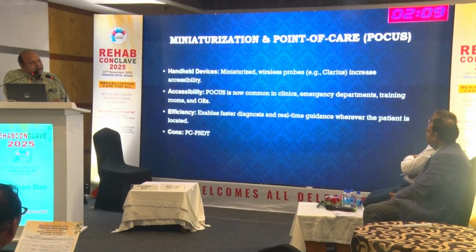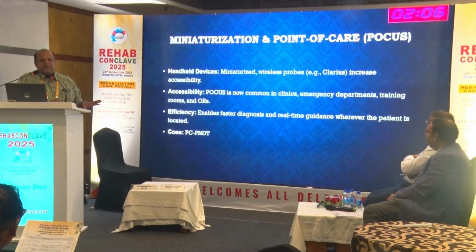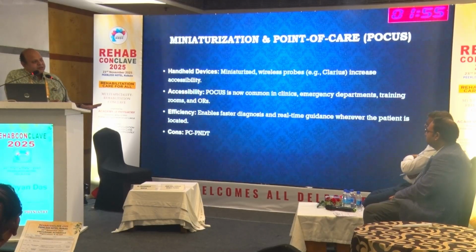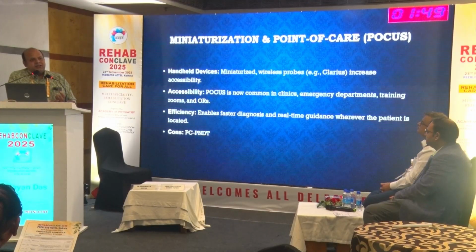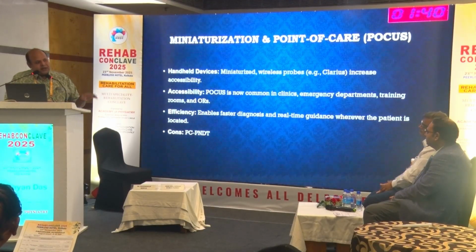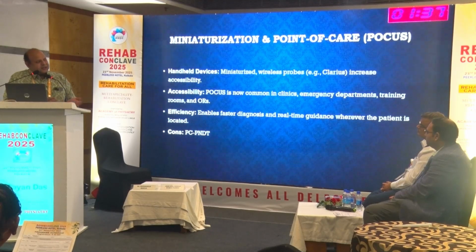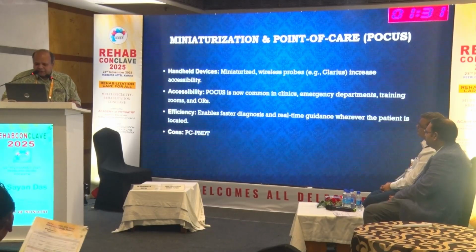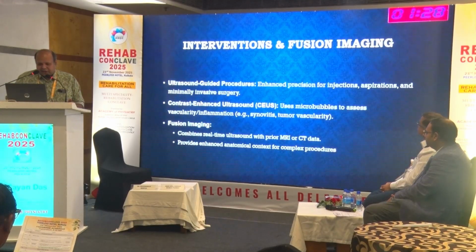Miniaturization and point of care. Unfortunately, this scope is not available in India because of the PCPNDT Act. You cannot register a probe which is handheld or pocket friendly. You must have a stationary machine in your institute. The point is you should not use this probe for diagnosing something else. But this is very handy. You put it in your pocket, go to your ward, just check the ultrasound, it connects to your phone, and you can diagnose by yourself and give whatever remedy you can.